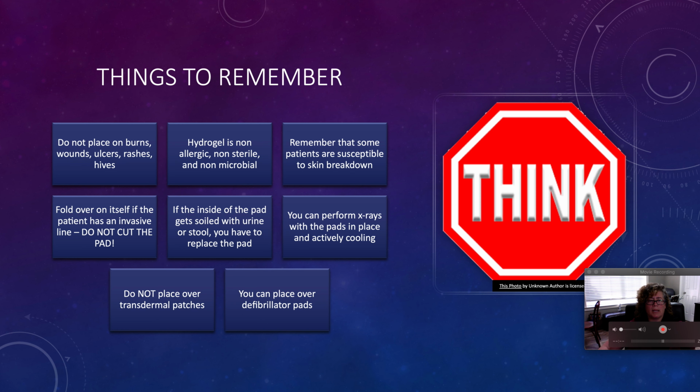You can perform x-rays with the pads in place and actively cooling. You also will place the pads over defibrillator pads, and yes, you can defibrillate while the Arctic Sun is cooling, but by that point you might want to just go ahead and turn it off. Do not place over transdermal patches. We all should know that one. It changes the way that the medication is absorbed.